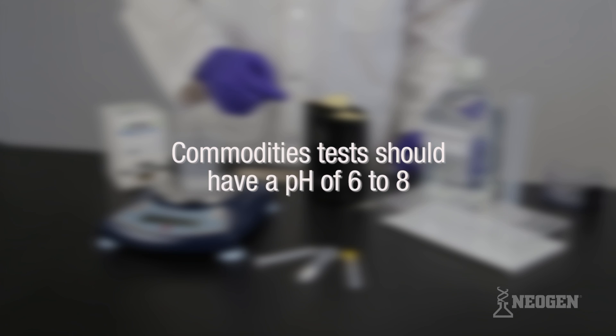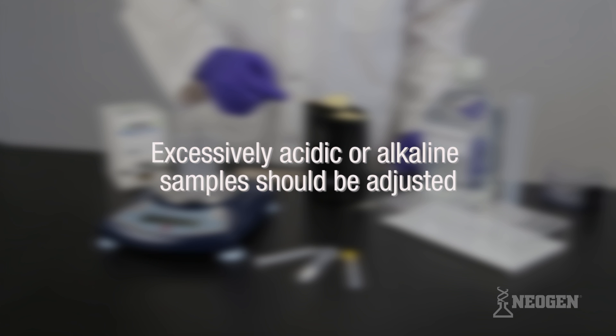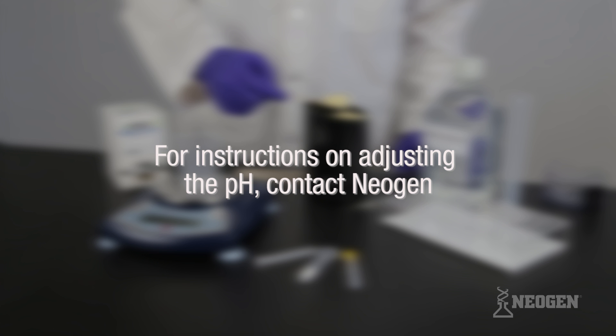Commodities tested should have a pH of 6 to 8. Excessively acidic or alkaline samples should be adjusted. For instructions on adjusting the pH, please contact your Neogen representative.